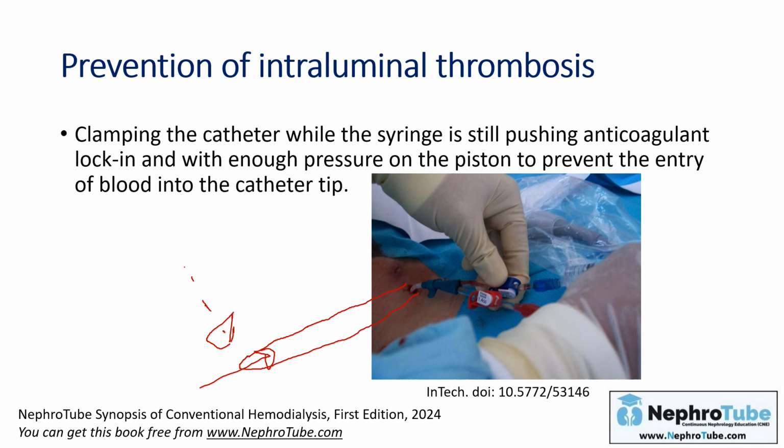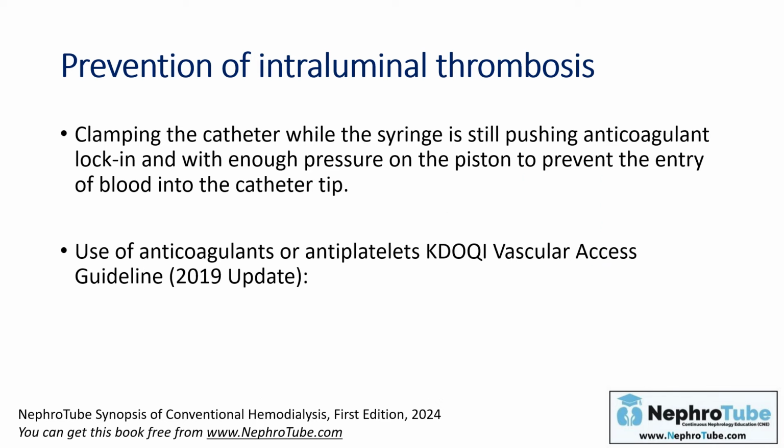This can be done by clamping the catheter here while the syringe is still pushing the anticoagulant lock in with enough pressure to prevent the backflow of blood into the catheter tip.